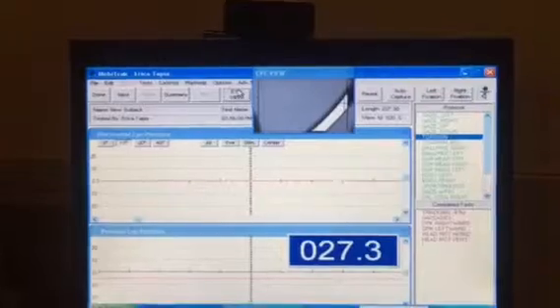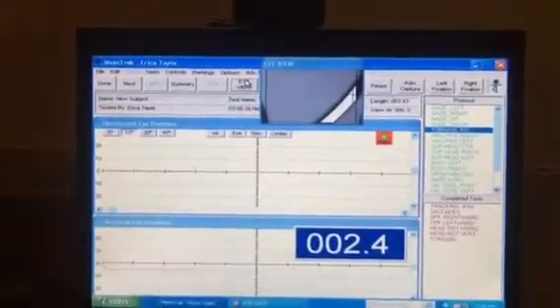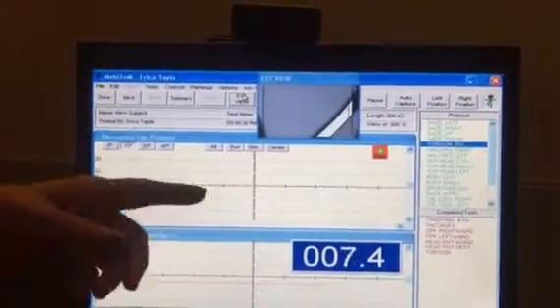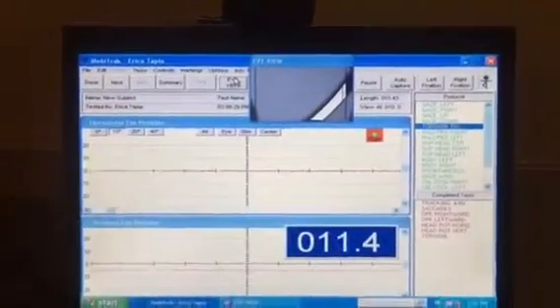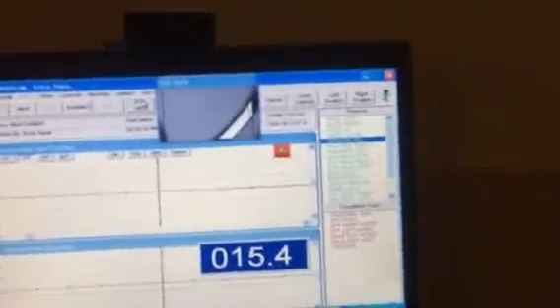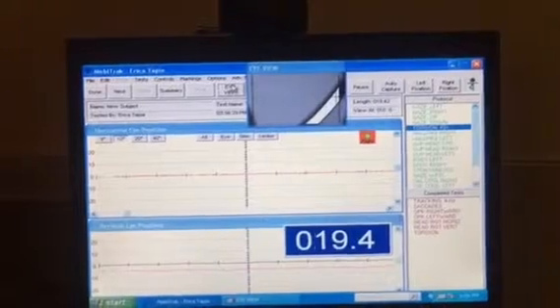You're swinging back and forth. Then the lights go on. You just hit next. This is when the lights go on automatically. Oh, okay. That's what I missed. You didn't mess up. Wait, it does that itself automatically? Yes, it does. It's built in on that test. Okay. So then you do the torsion. They're still doing the same motion, but the lights are on, and those large icebergs should be smaller.